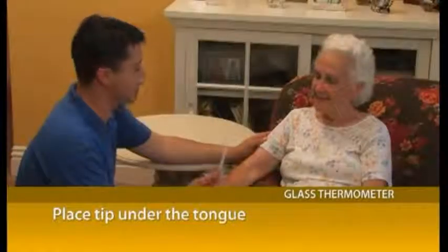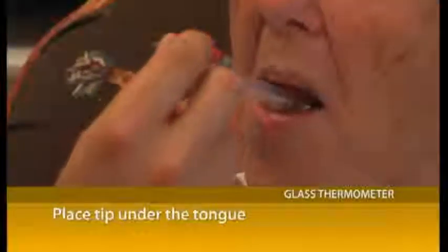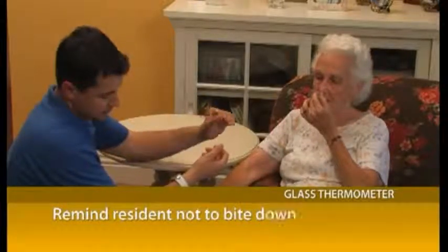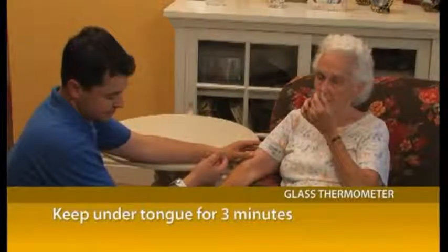Ask the resident to open her mouth. Place the end with the colored tip under her tongue. Ask the resident to gently close her lips around the thermometer. Remind the resident to not bite down on the thermometer. Keep the thermometer under the tongue for 3 minutes.